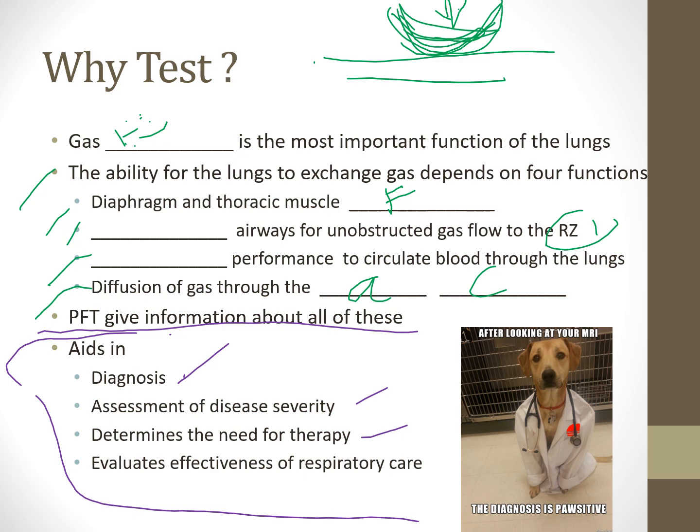And then if it increases by over 12% or 200 mLs, then we know that they are responsive, that they need that therapy, right? It determines that they need that therapy. It's something that their body responds to.